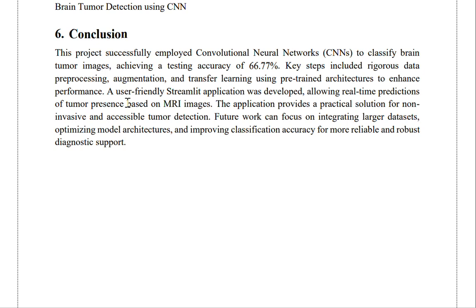While the accuracy isn't perfect, it's a solid baseline given our dataset size and complexity. With further tuning and more diverse data, this model can definitely improve. More importantly, the results prove that deep learning can be a powerful non-invasive tool to assist in early detection of brain tumors.